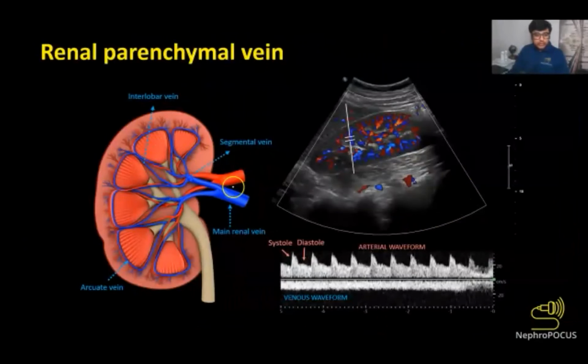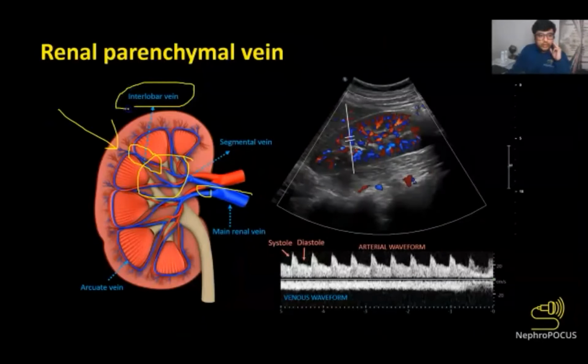So where do you perform intrarenal venous Doppler? So you have the main renal vein, you have these segmental vessels outside of the kidney parenchyma, but we are more interested to know how the kidney parenchyma is handling the congestion. So you want to image these vessels here, which are in line with the Doppler wave, or the ultrasound beam, which is the ideal place to Doppler. So you scan these interlobar veins, and interlobar veins and arteries, they're very close to each other, they are very tiny.